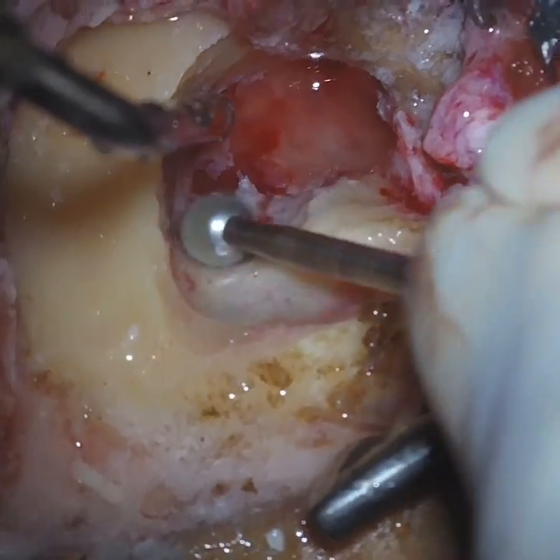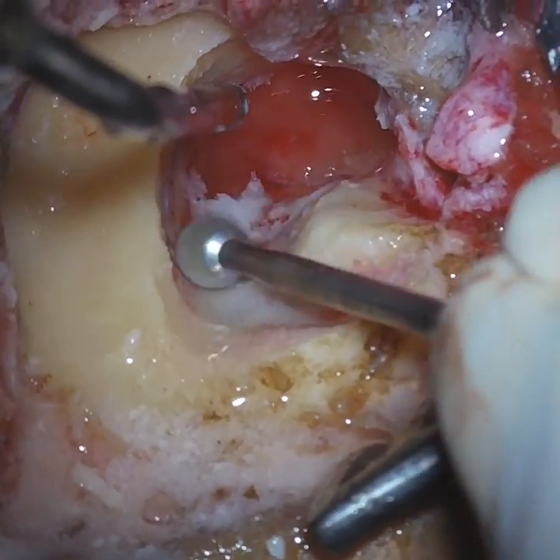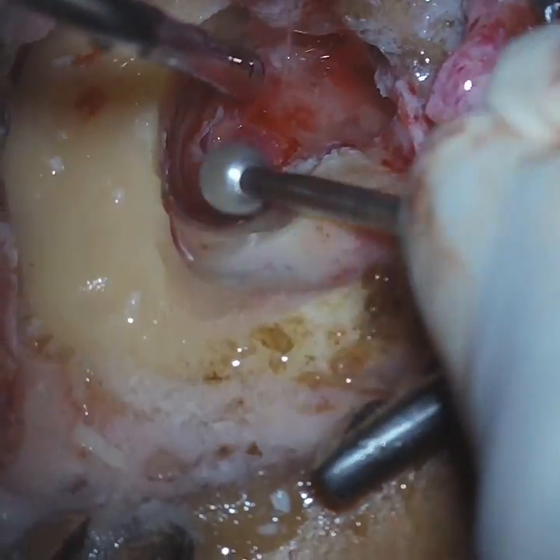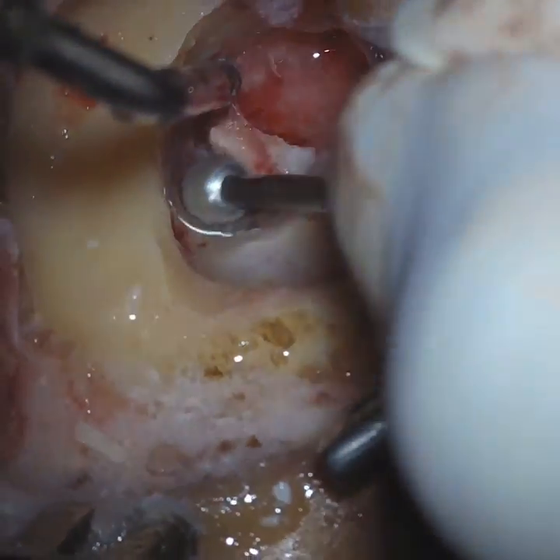Here you see we are exposing the cholesteatoma. No attempt has to be made at prior extraction of the cholesteatoma. First you just expose the cholesteatoma. Now the moment we lift the cholesteatoma sac, you see the fistula is coming into view.